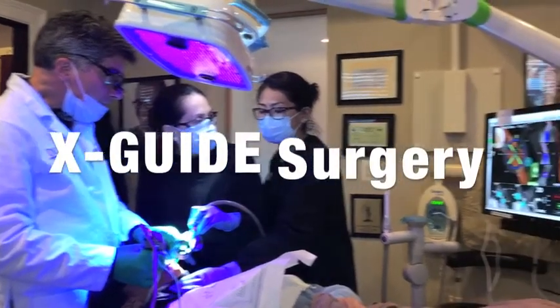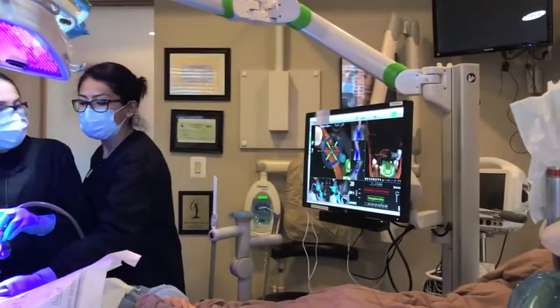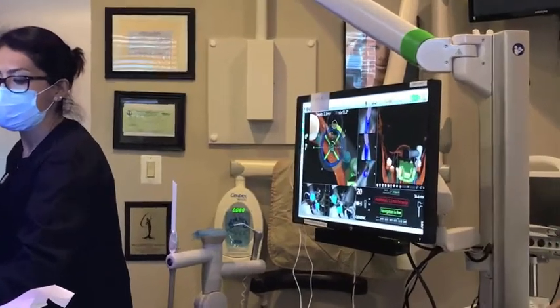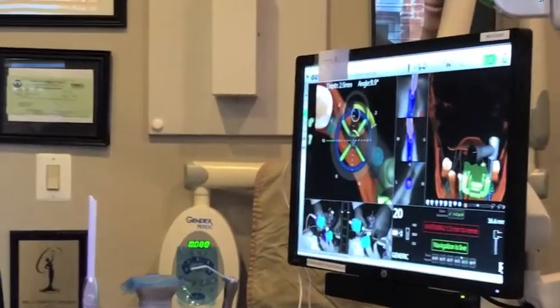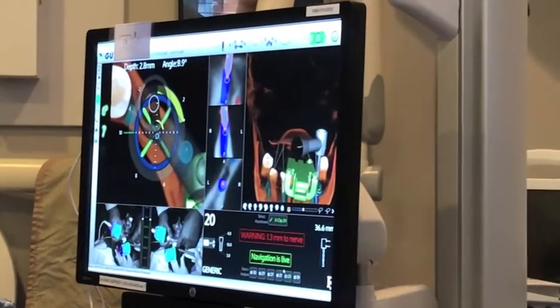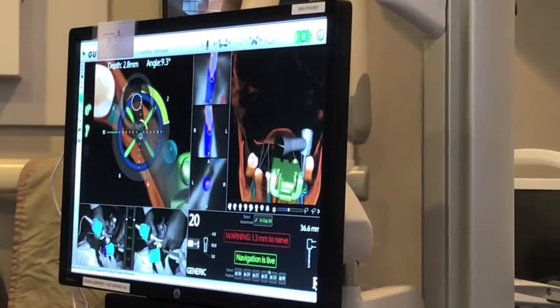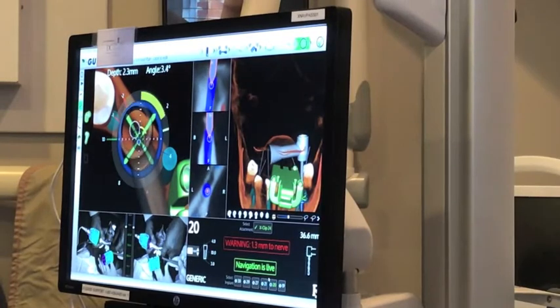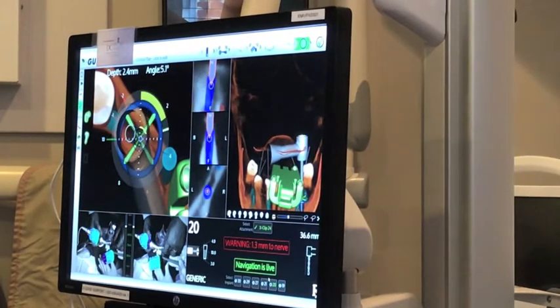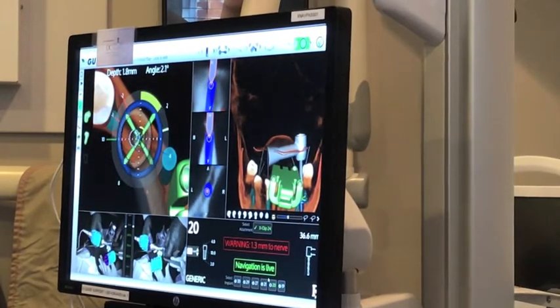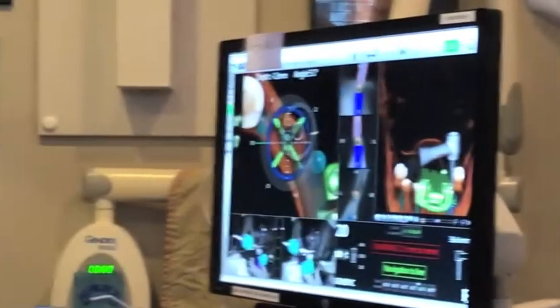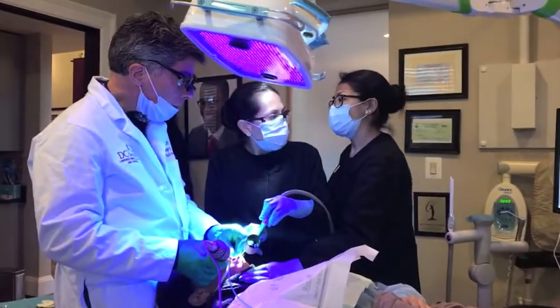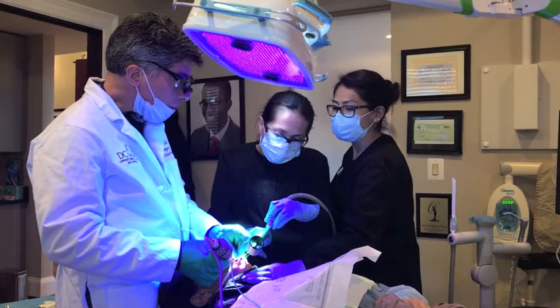During the live surgery, you will notice that the handpiece and drill are seen virtually on the screen. Dr. Singer is able to use the XNAB technology as a GPS to position the handpiece at the correct position to allow for implant placement precisely according to his plan.